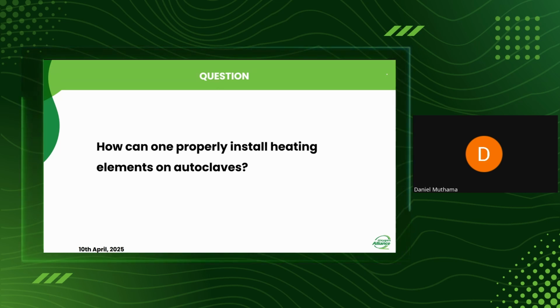If the electric heating elements are two sets, let's say one holder with three elements and another holder with three elements, the total is 6 elements. You short two terminals of two elements and supply with the live line. You also short another two terminals of two different elements and supply with the yellow line.